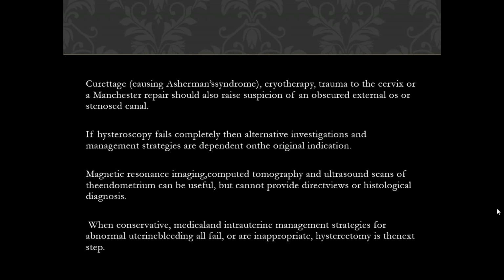It depends on the surgeon's experience and is associated with different side effects and risks, although the best image is associated with CO2 distension media. Now we have to choose between saline and glycine. Saline and glycine.